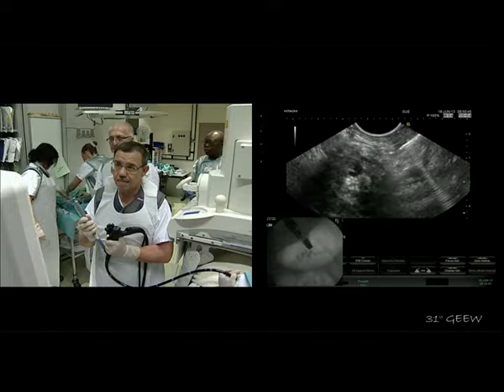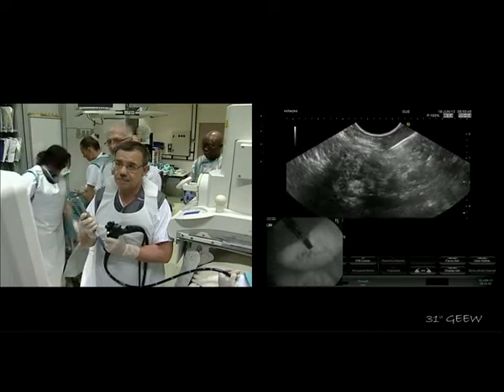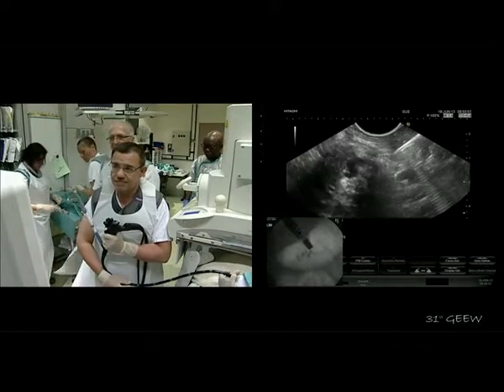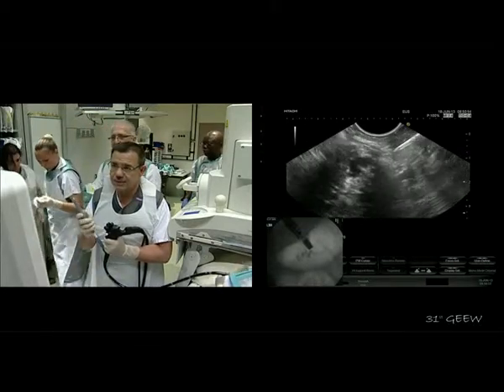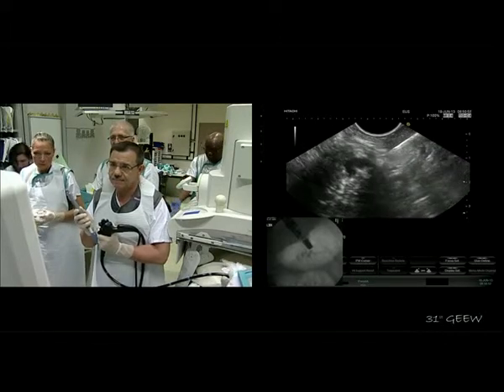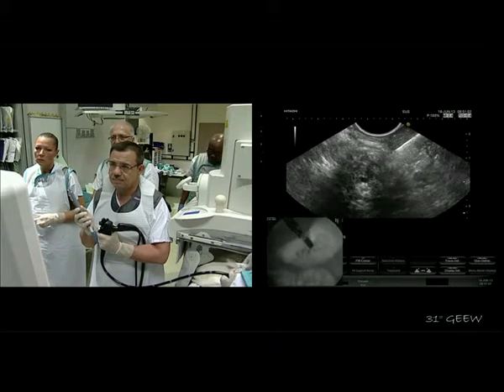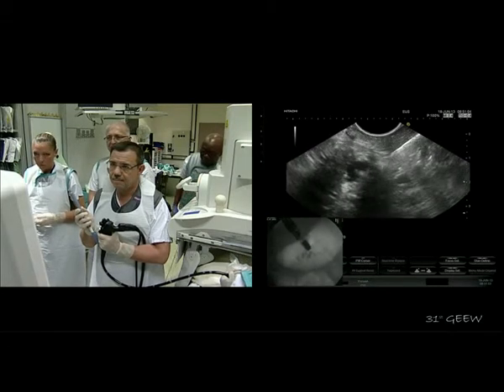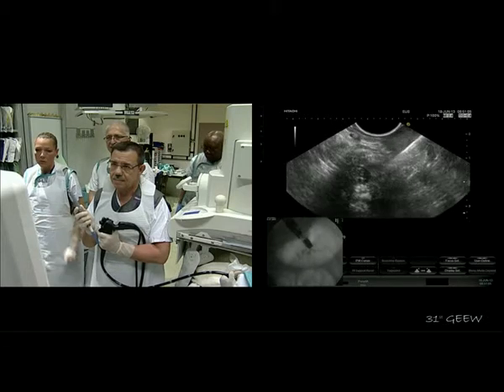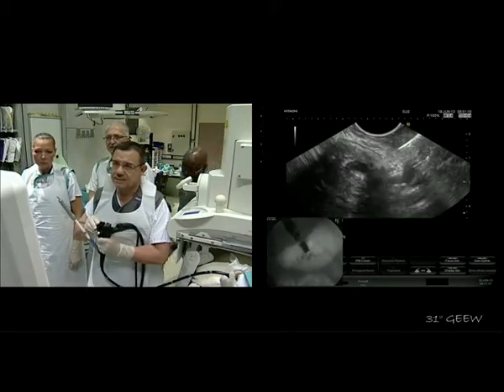And you're still using the access needle? No, we are. Mark prefers the regular 19 gauge in this case, yes. Very difficult.